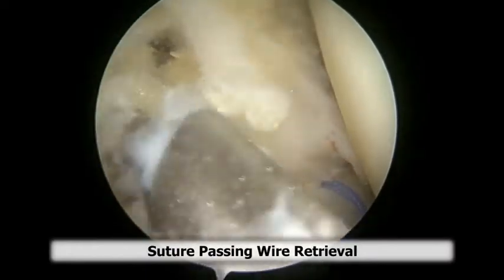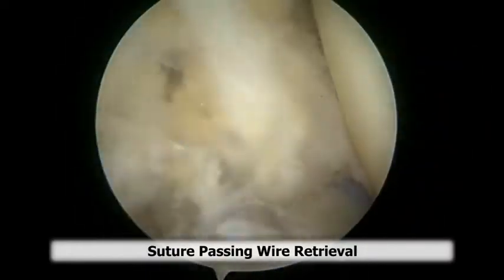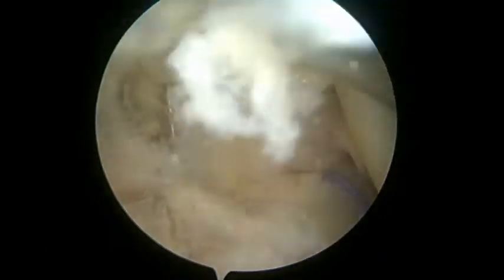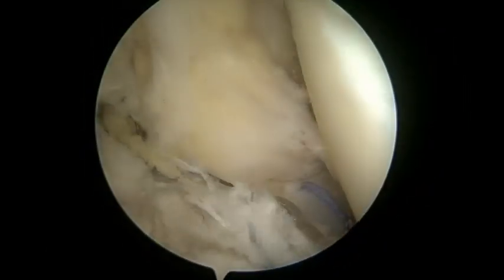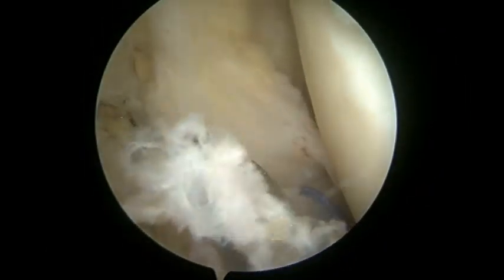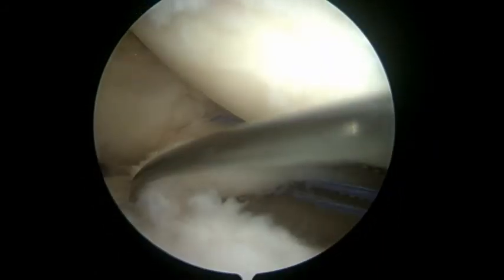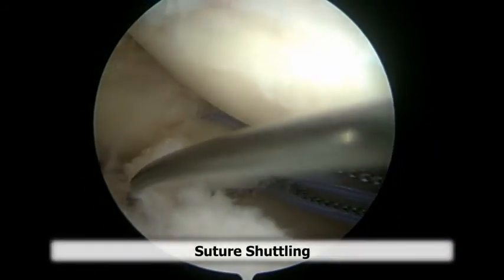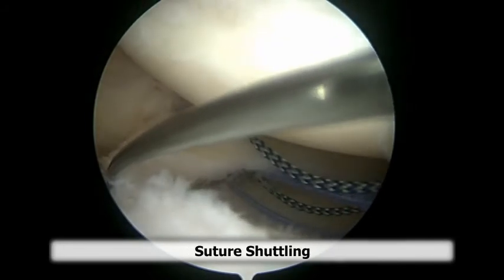We then used a suture passer to retrieve the sutures down through the tibia. The suture passer was retrieved through the medial portal with a looped grasper, and the sutures were shuttled back through the tibia using the suture passer.